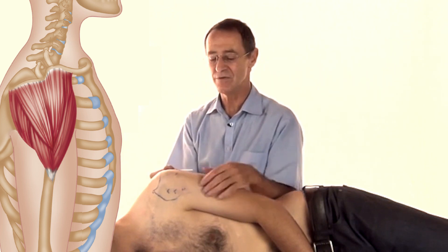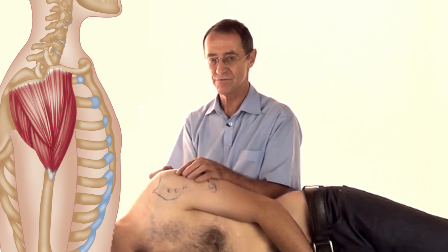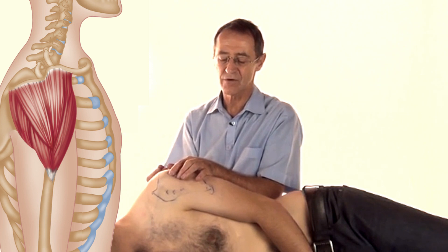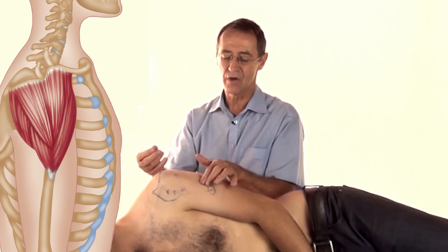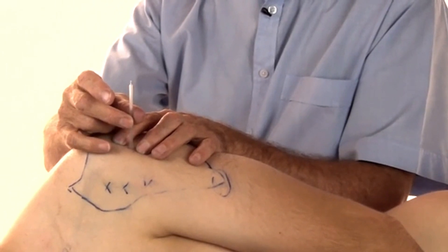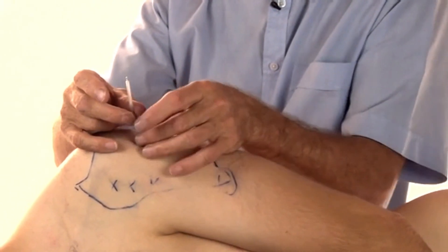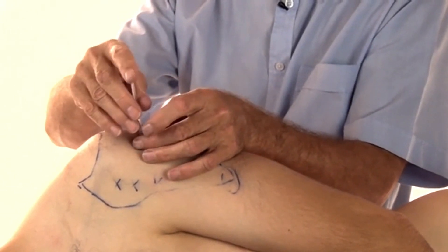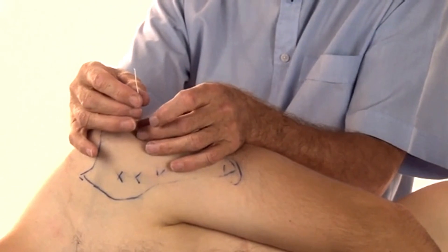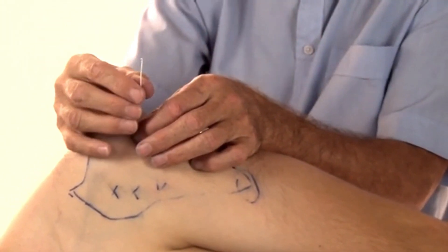The way you needle is that you search for the trigger. Once you've found the trigger, you put your finger on either side along the long axis, place your introducer over the trigger itself, give it a tap, withdraw your introducer, and you can go vertically down.